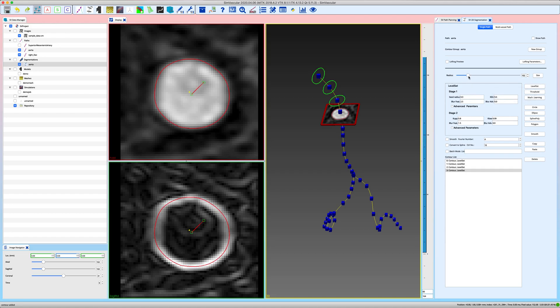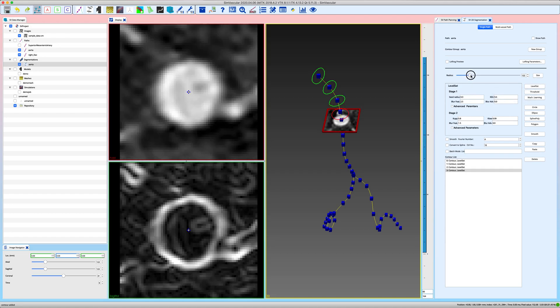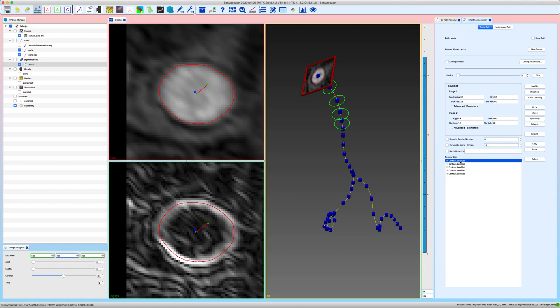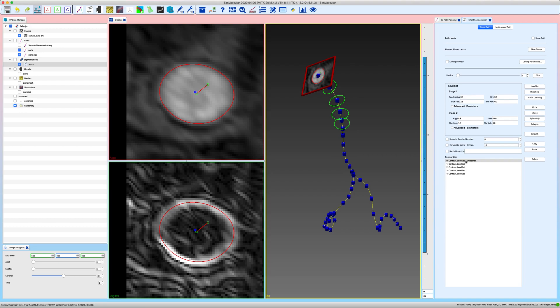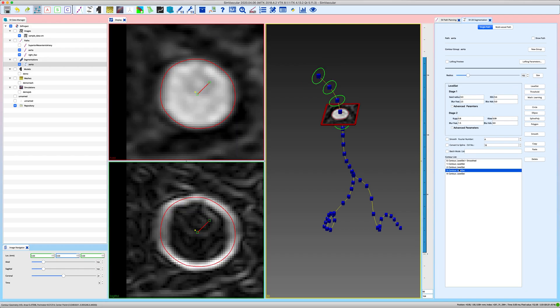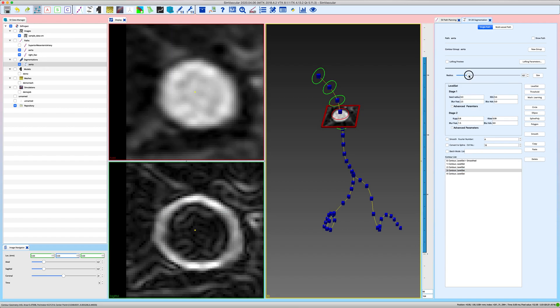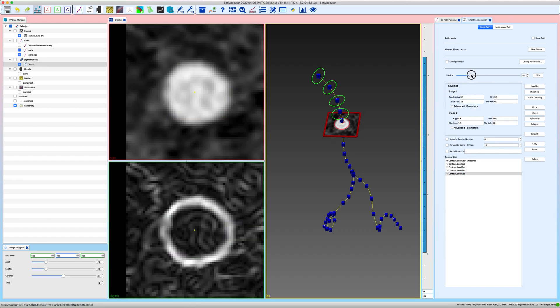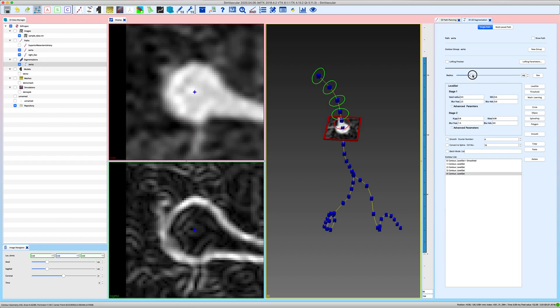If for some reason at any of the locations you are not too happy with the result, you have a few options. You can click on the contour that you want to change. For example, if you want to smooth it. So here is a little edge down there. If you want to smooth that out click on smooth, and now in the contour list the specific level set will show up as contour and level set plus smooth. Let me go to a location where it might be more difficult for the level set algorithm to find a good solution. Here for example there's a branch coming off that in this model we are actually ignoring. But if I use the level set method to find the segmentation then of course it will travel inside of that branch and this is not what I want.